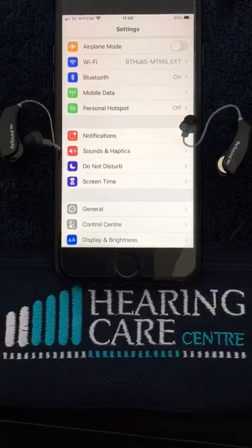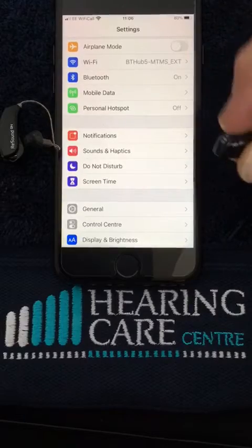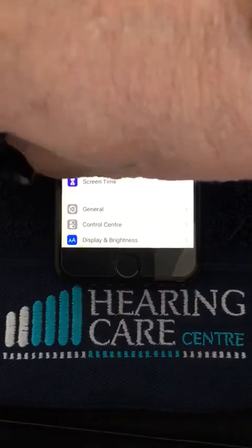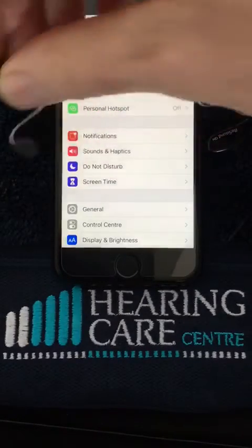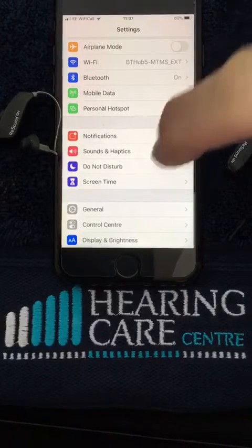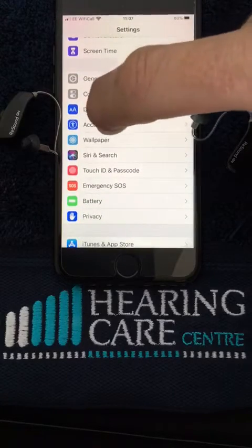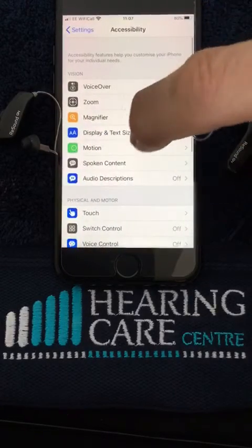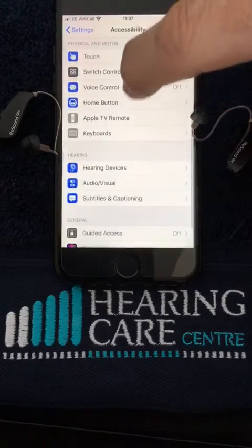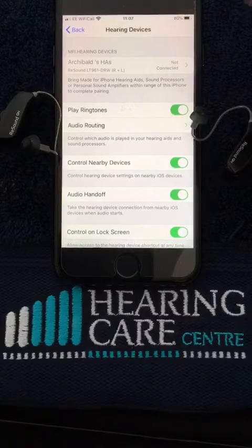We then need to switch our hearing aids on by closing the battery doors with new batteries ideally. If you're using the rechargeable hearing aids, just take them out of the charger and they will switch on. We'll scroll down to the Accessibility tab and again scroll down until we get to Hearing Devices.